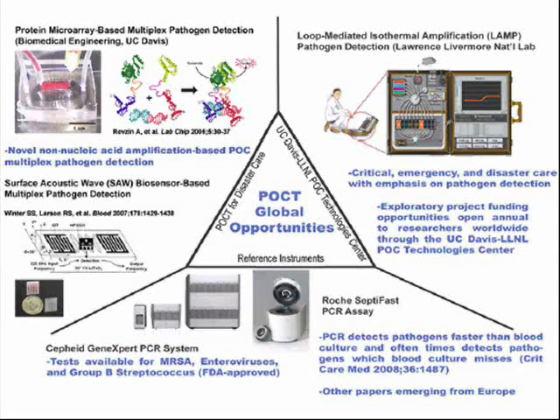The next device that is funded by our center, albeit not optically based, is still worth mentioning. It's using a surface acoustic wave biosensor. This is from Dr. Richard Larson from the University of New Mexico in collaboration with Sandia National Laboratory. The device is essentially a chip with a grid of antibodies in the center. Opposing on either side are transducers, which generate a surface acoustic wave.